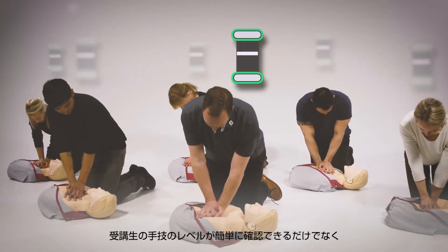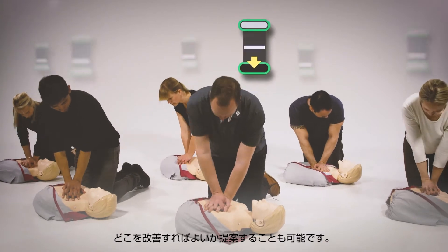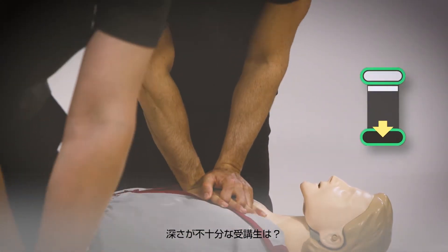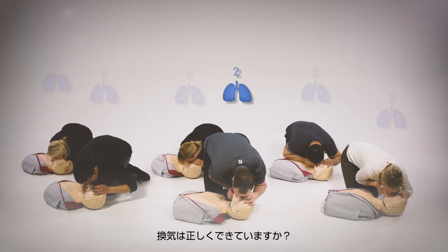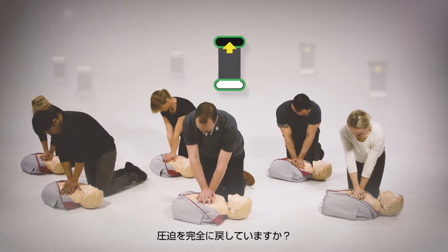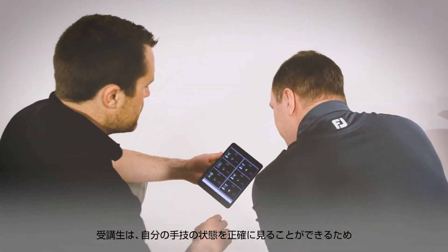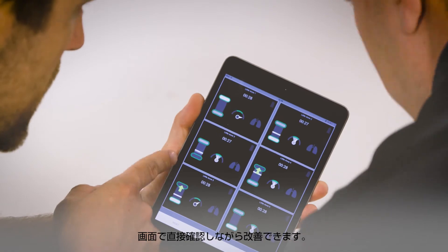Not only can you easily see performance, but areas for improvement are suggested. Is one of your students compressing too slowly or not deeply enough? Is your student ventilating correctly? Are compressions fully released? By showing students exactly what they need to work on, it's easy for them to make adjustments and watch their improvement directly on the screen.